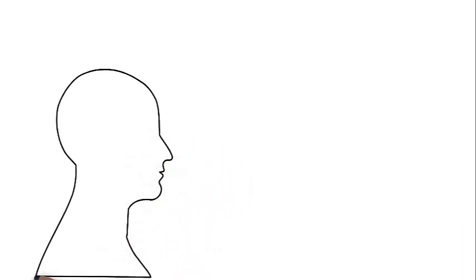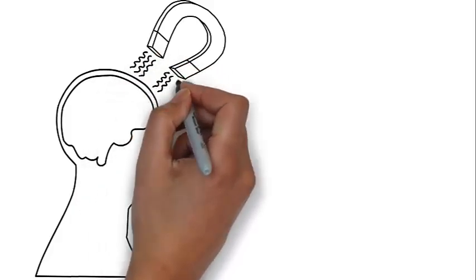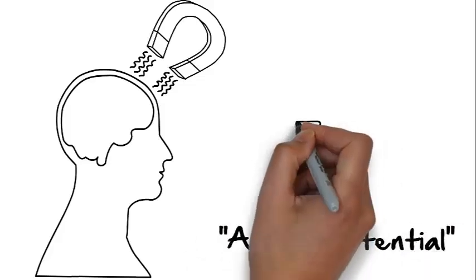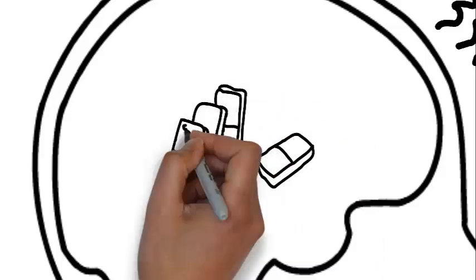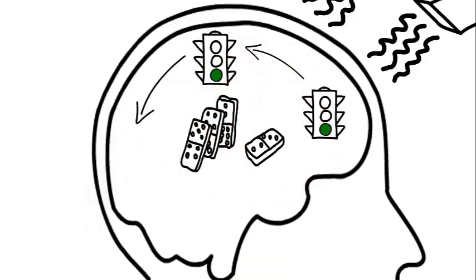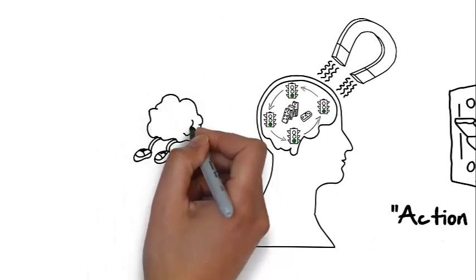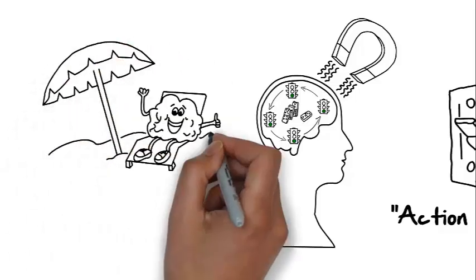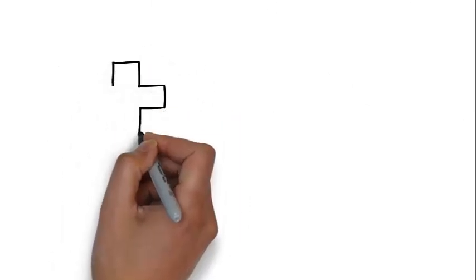Now let's look at how the treatment works. In TMS, a magnetic coil is placed over the head and uses an electromagnetic field which provides enough energy to cause the neurons at the surface of the brain to reach what we call an action potential. This is a fancy way of saying that the neurons turn on. And like dominoes, those neurons send messages that cause other neurons to fire, which cause other neurons to fire, and so on and so on. This roadway of neurons reaches deep areas of our brain, specifically the limbic system that we talked about earlier, and practices and works out the known pathways of our brain that are associated with being more happy, being less anxious, and being more relaxed and content. Remember him?